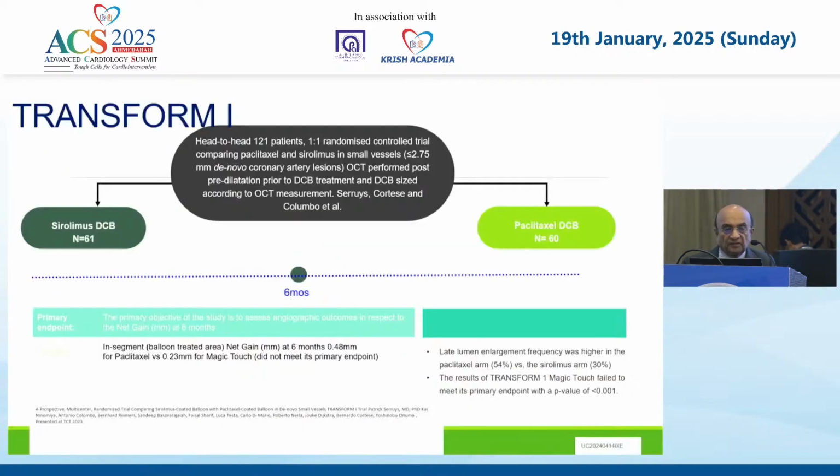And I think the studies are now ongoing on which one to use, sirolimus or paclitaxel. Dr. Colombo believes that if you have prepared the lesion well and you have released the elastic recoil by cutting balloon and without dissection and a good TIMI 3 flow, I think a drug balloon will take over the stent, and you might not have to use a stent in future. This is especially true if you are dealing with a bifurcating lesion, CTO, and the distal lesions.